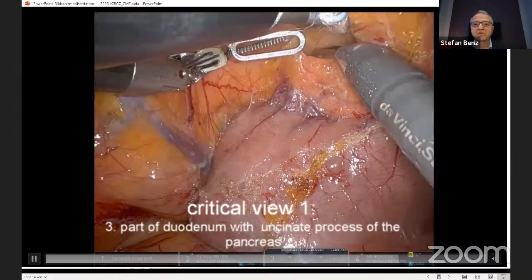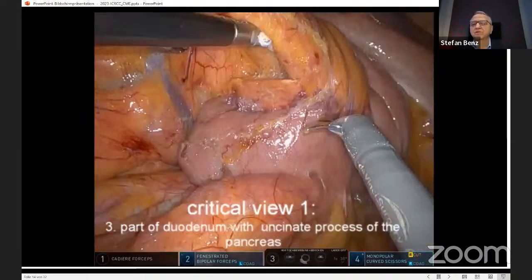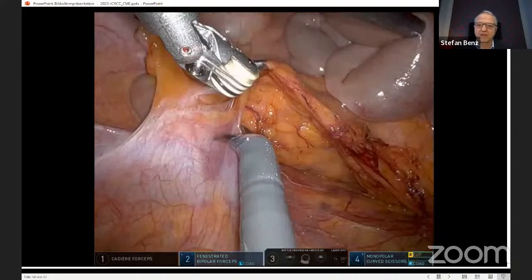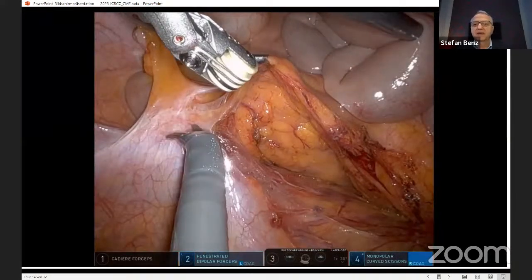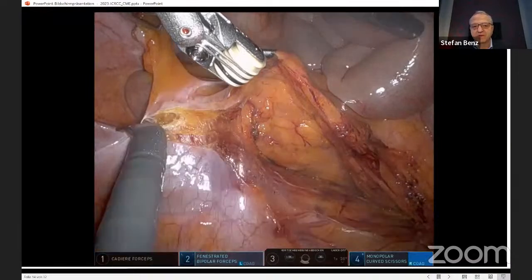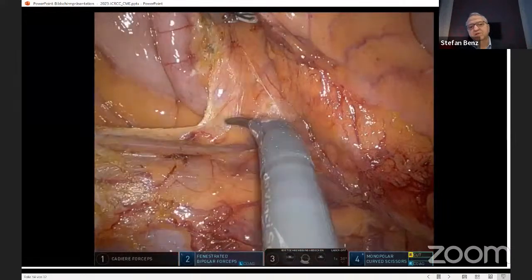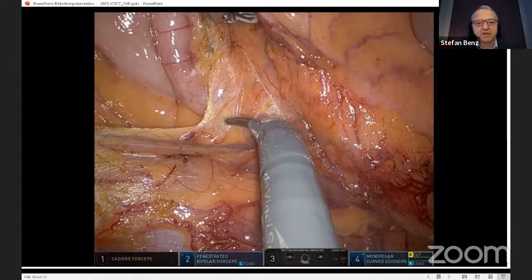Now this way you get a mobilization exactly the same way as Kocher had it when he did it from laterally, and it's also the same plane you follow. Then you divide the peritoneum in direction of the cecum, and then the whole thing is mobile.